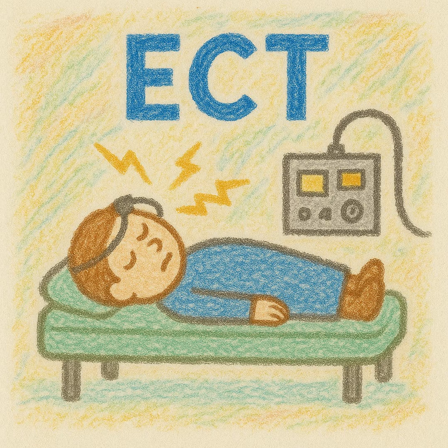Oftentimes you'll see it measured in terms of percentage, like a dose of 20%. And that's just the percent of the maximum device output. So if your device can maximally output 500 millicoulombs, then if you set the machine to deliver 100 millicoulombs, then the device might give that an intensity percentage of 20%, because that's 1/5. Those are the main parameters.